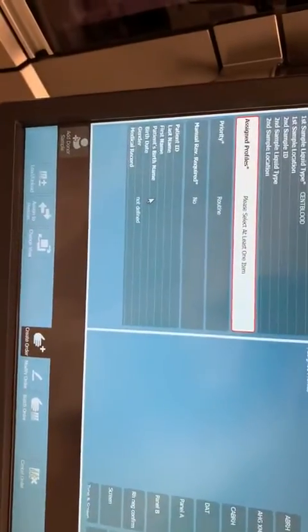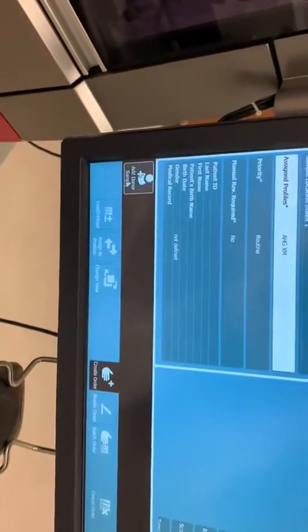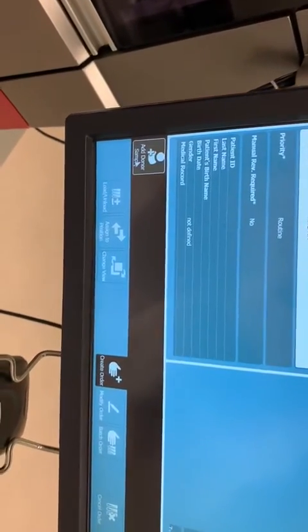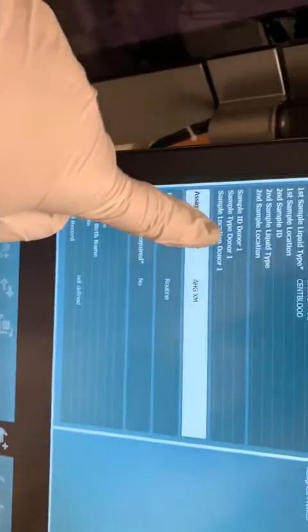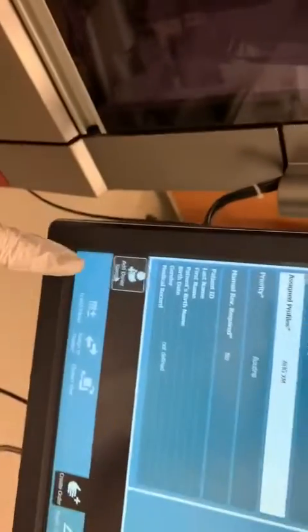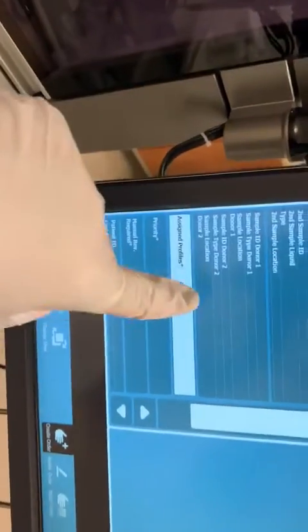Click on Profile, then Cross-Match, and go down here to add donor samples. It adds donor one. I want two donor samples because I have two units on here, so I'm going to add it again and it's going to add me a second one.